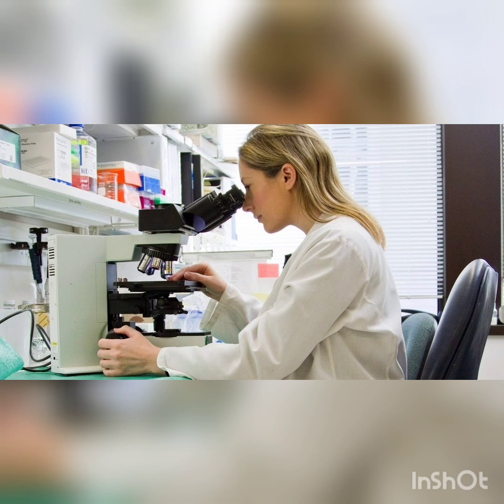For a systemic fungal infection, the specimens collected from the patient, that is sputum, bronchial secretions, bone marrow, or purulent material, need to be inoculated as early as possible without any delay.